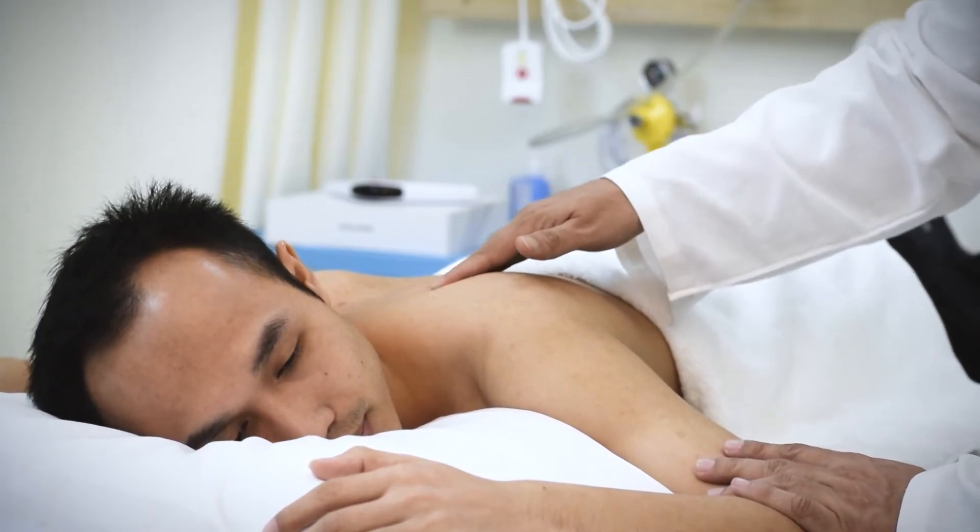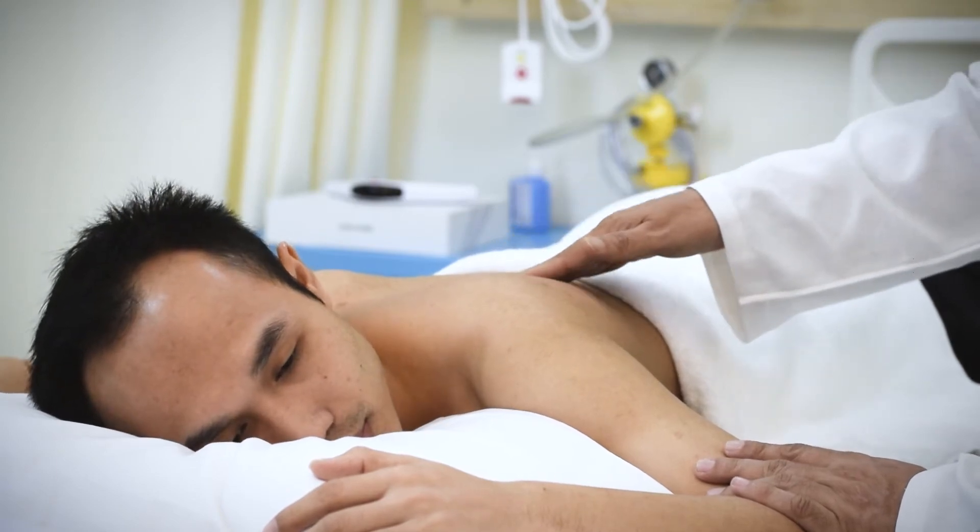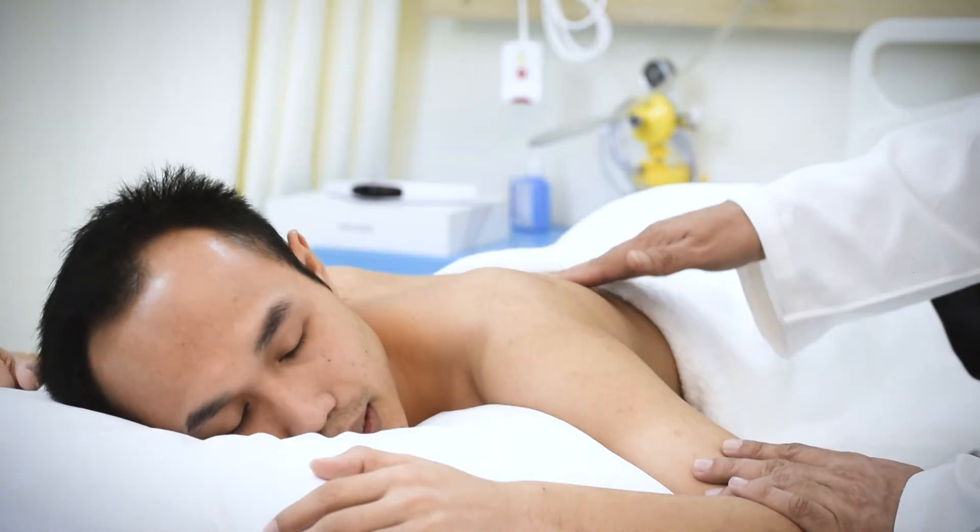Identify the tender points and concentrate the treatment with Cura Laser over this area for optimum results.